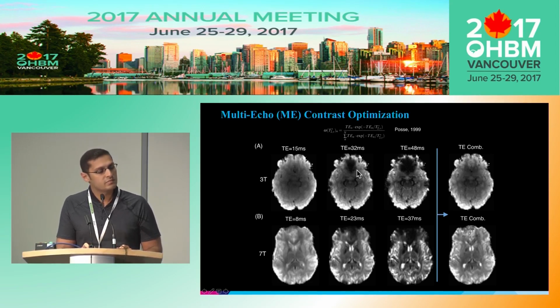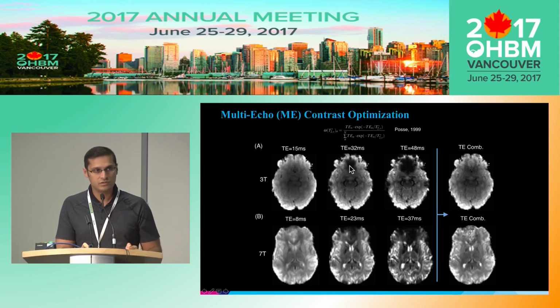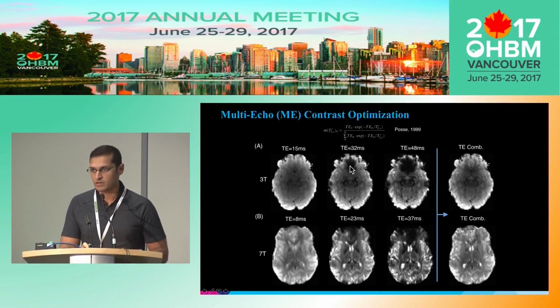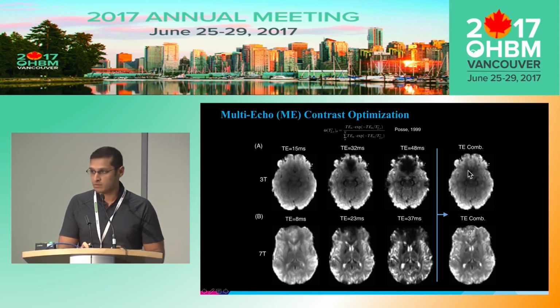The reason why that works is that the reason you have a susceptibility artifact, the reason you have a hole in the brain, is that the signal has decayed away before you've actually captured it. And it's decayed away because the proximity to air-tissue interfaces creates an unstable magnetic field, which basically speeds up your T2 star and it vanishes. But if you acquire the image at an early time, you can actually sample that signal. And then by estimating T2 star at every voxel, which you can do, and using that as a weight mask for combining, you can actually recover orbitofrontal cortex and inferior temporal regions.